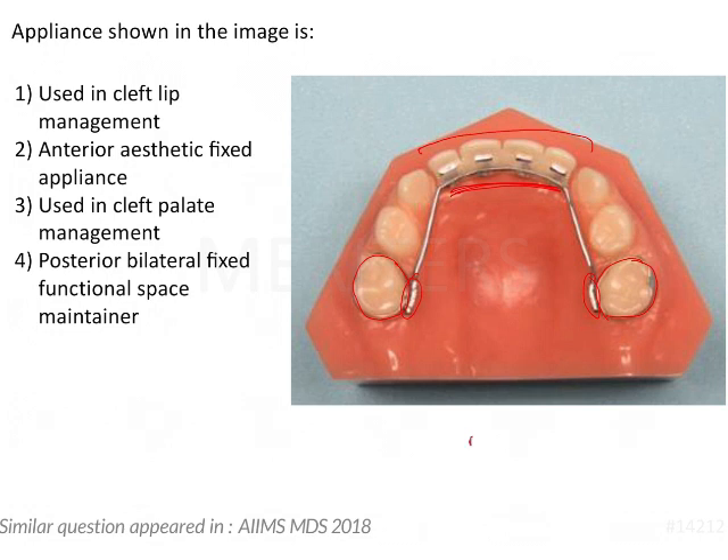Although this wire appears like a Nance palatal appliance or a space maintainer, it is actually not touching the palatal aspect at all. There is no support being derived from the anterior aspect. So this is not a posterior bilateral fixed functional space maintainer. What it is is an appliance replacing the anterior missing teeth, because the incisors are missing.